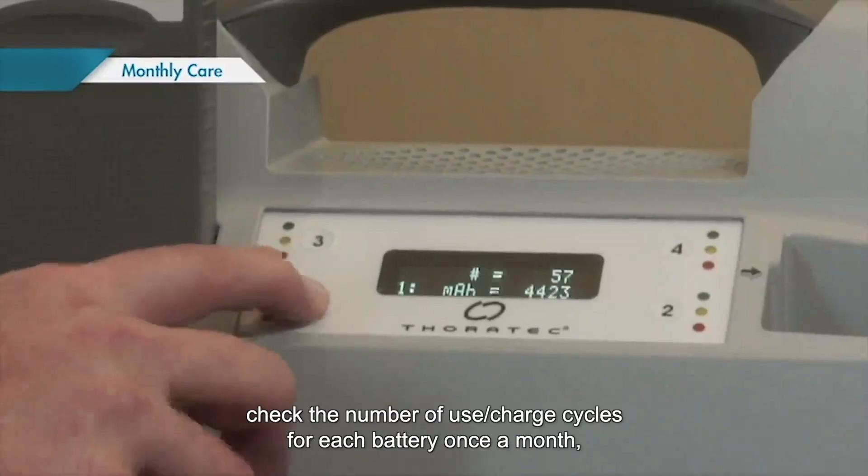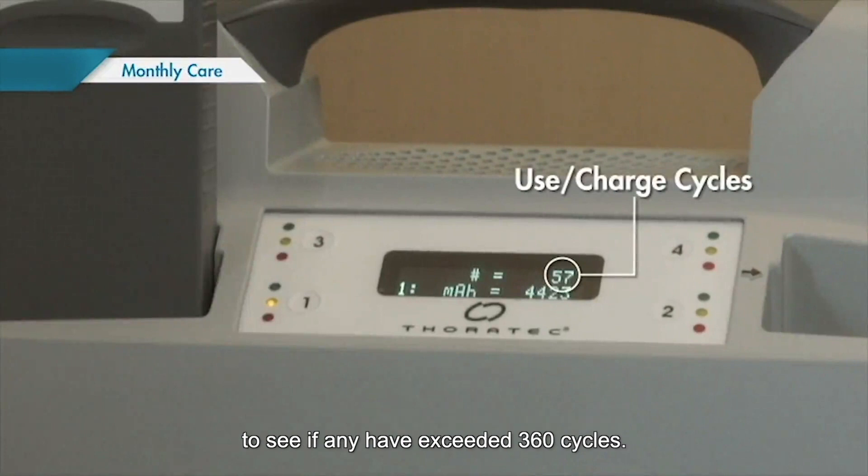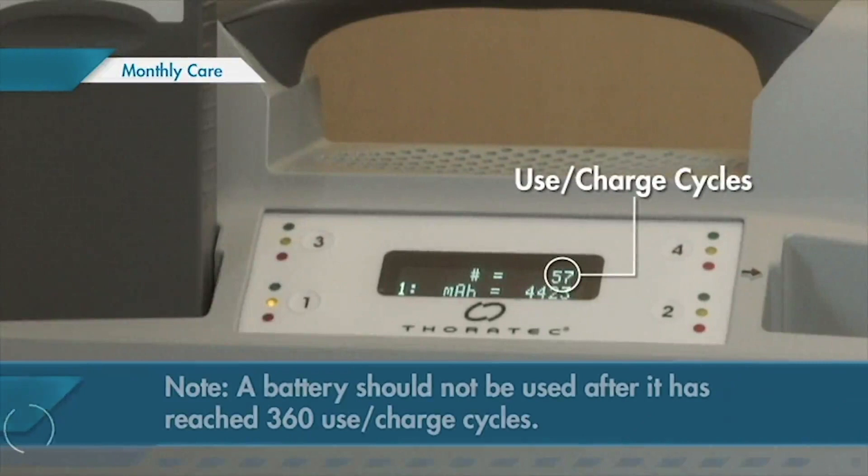In addition, check the number of use charge cycles for each battery once a month to see if any have exceeded 360 cycles. A battery should not be used after it has reached 360 use charge cycles.